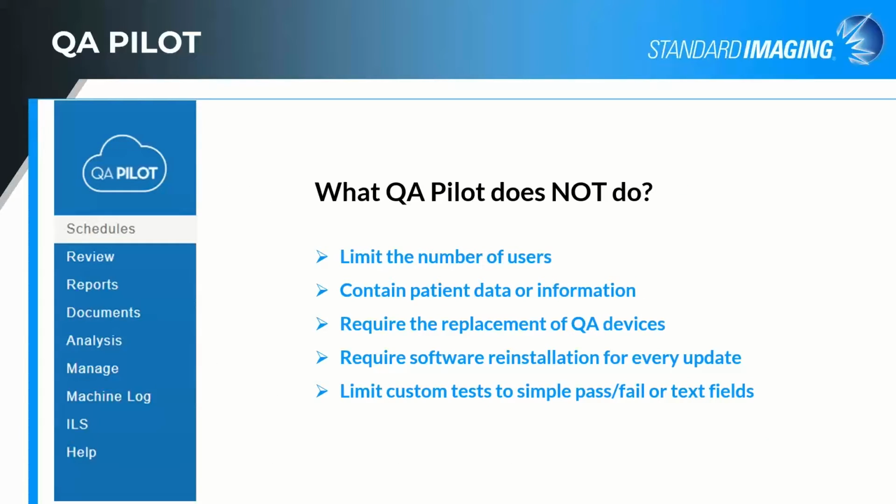It is also worth noting what QA Pilot does not do in order to make management easier. These are things it does not limit you to or does not do, which in fact makes your life just that much easier, right? It does not limit the number of users. It does not contain patient data. It does not require the replacement of QA devices in order to integrate device data. It does not require software reinstallation at every update, the beauty of the SaaS model, and it does not limit custom tests to simple pass-fail or text fields.